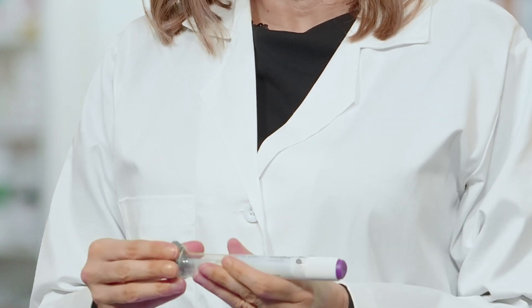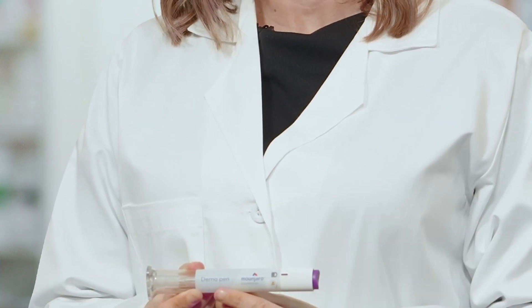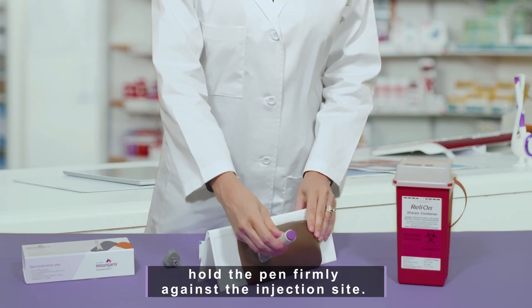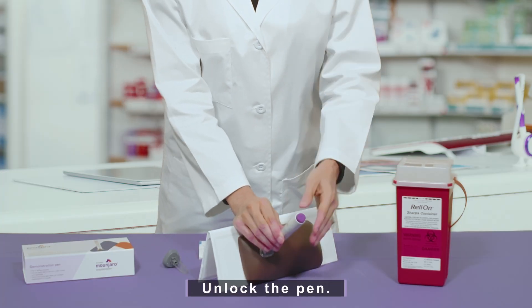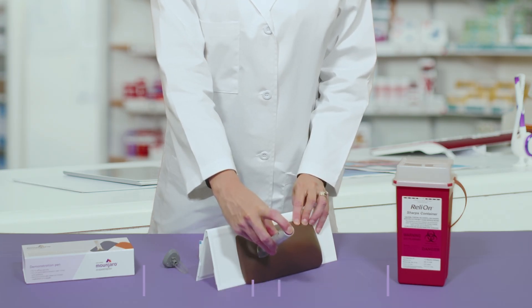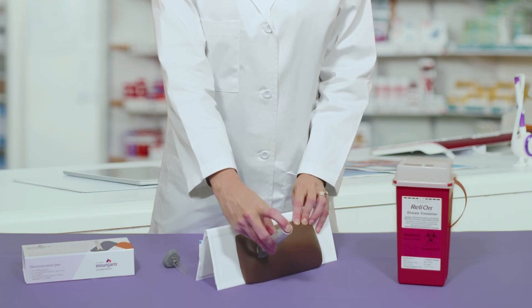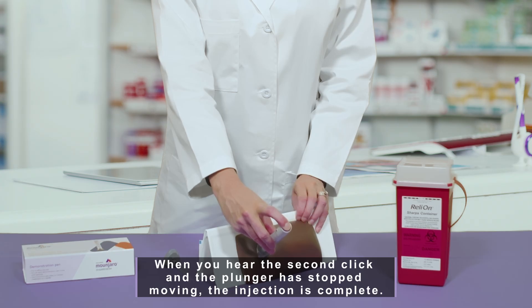With the base cap off and the pen in the locked position, hold the pen firmly against the injection site. Unlock the pen. Press the button — you will hear a click. Hold the button down until you hear a second click. The plunger will move through the medication window. When you hear the second click and the plunger has stopped moving, the injection is complete.